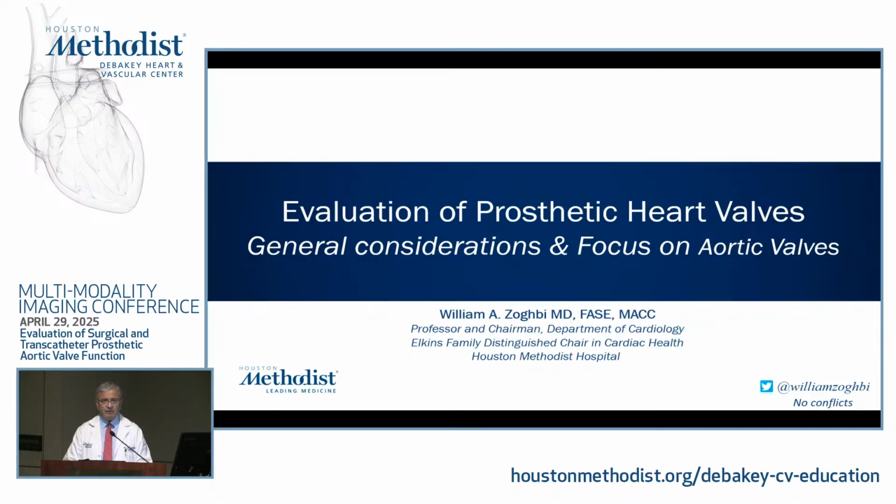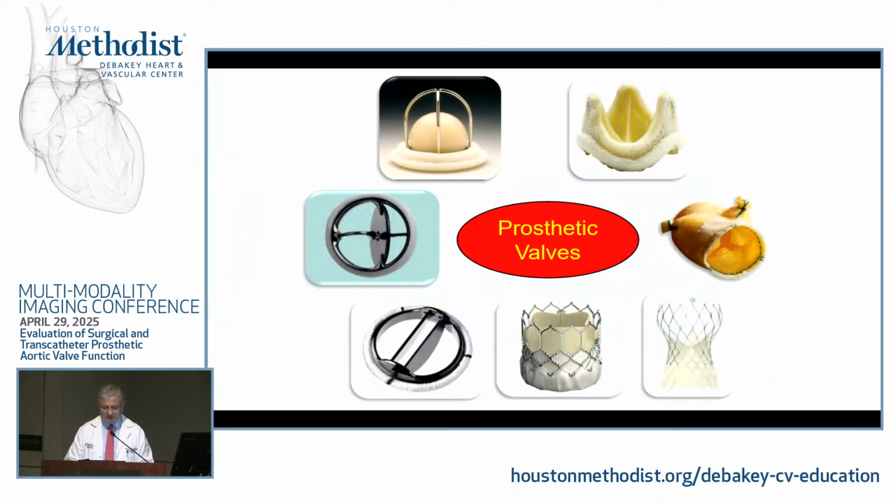So today we will start with an overall evaluation on general considerations of prosthetic valves and focus on the aortic valve. With me also will be Dr. Chang, who is the Director of Cardiovascular Imaging at Houston Methodist West, Associate Director of the lab here, and who will be addressing advanced imaging with CT and MRI in the applications of evaluation of prosthetic valves, particularly the aortic valves. And I know we will have a session on mitral valves and other valves later on. So let's get started.